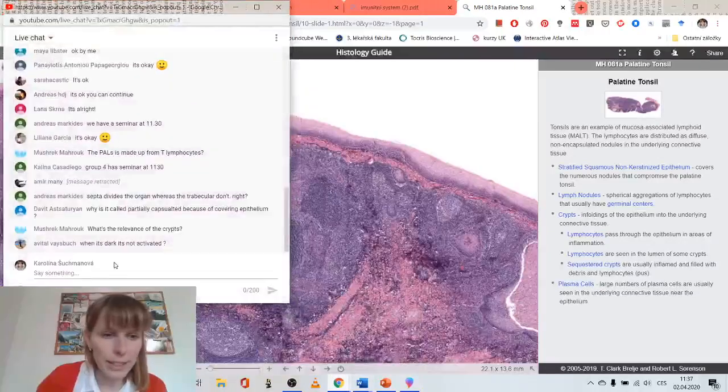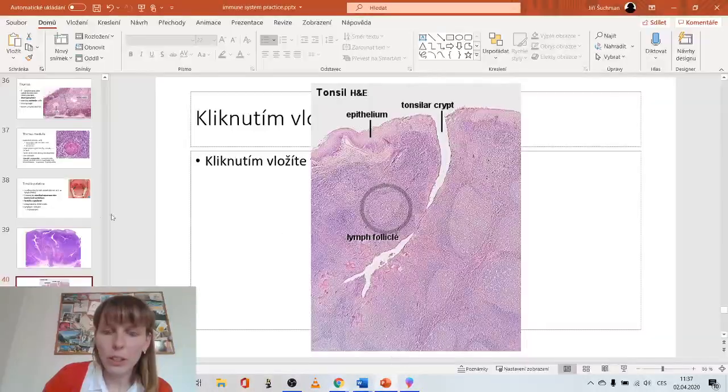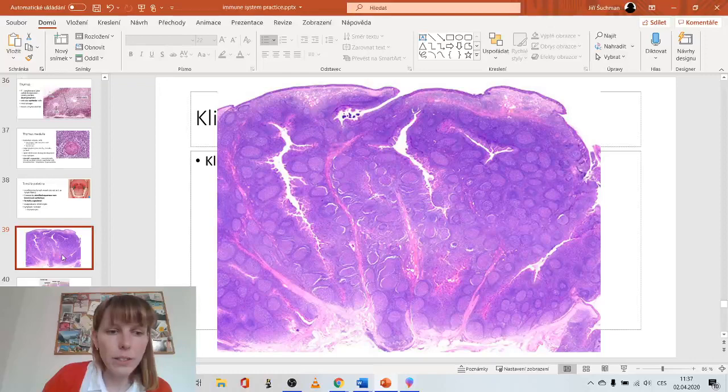So that's it. Yes. And so we saw everything that we needed to see in the tonsil.